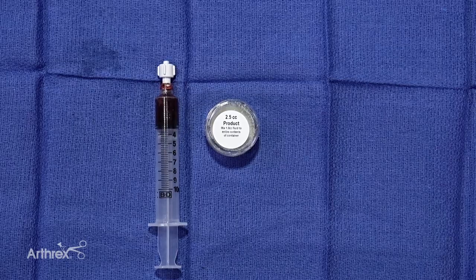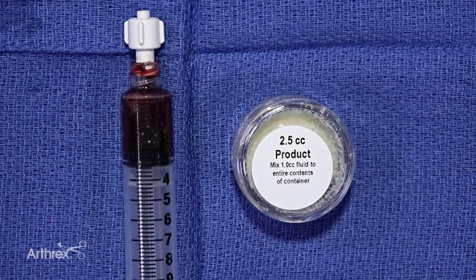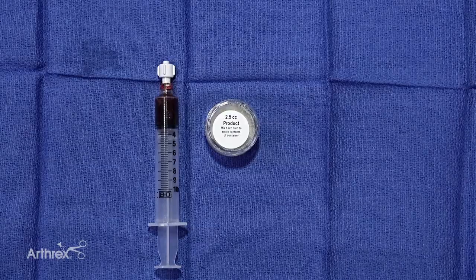What you can see here is 2.5 cc's of Allisync pure. The important thing to understand is that it's 100% bone without the need for a carrier. The cells and product we're able to isolate from the Angel spin down are able to bind with that and do not need a carrier to stay with the graft. On the left is our yield from the Angel spin down — 3 cc's of concentrated PRP from the iliac crest in this case.